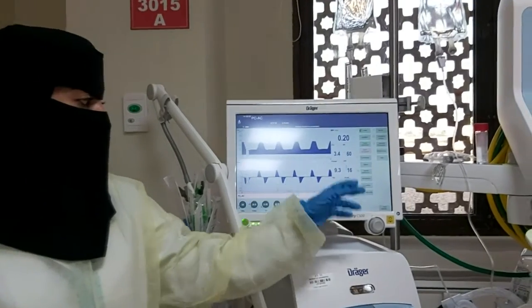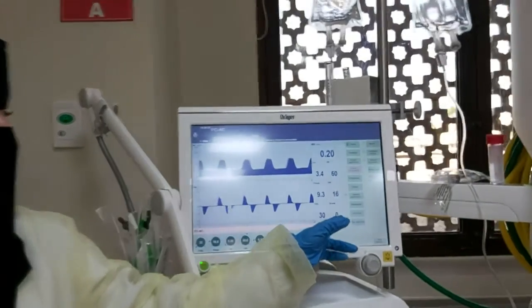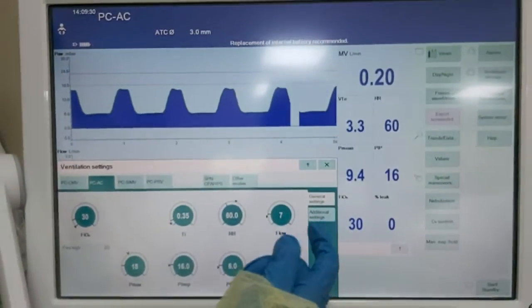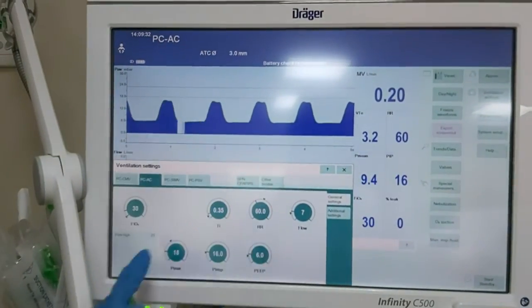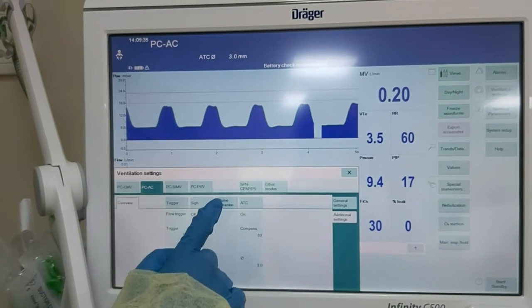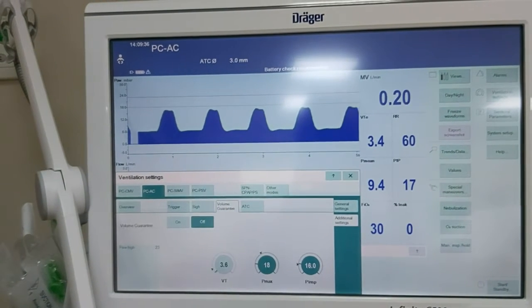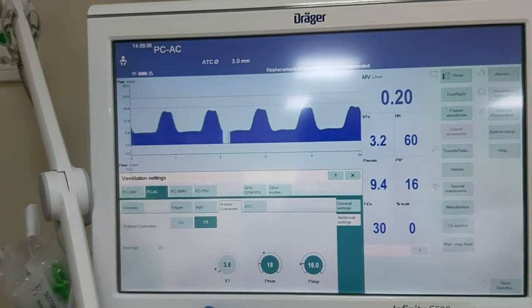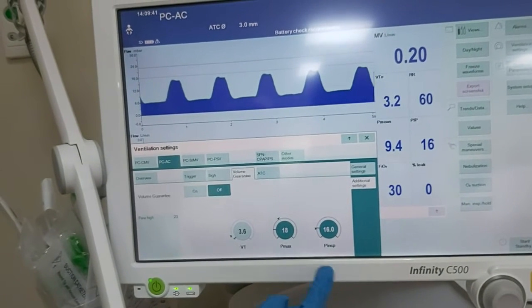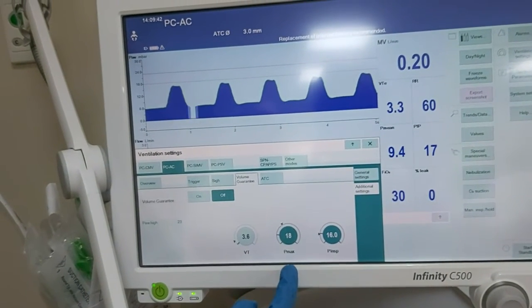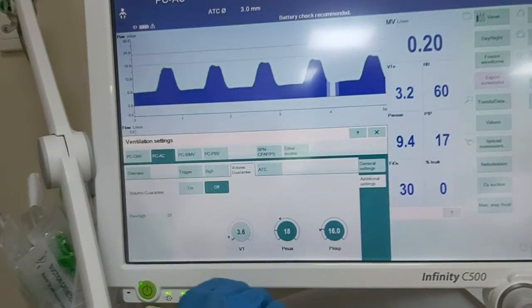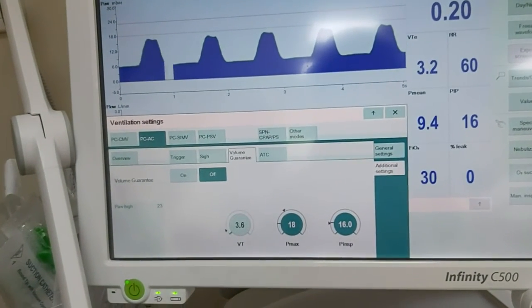To add volume guarantee, we put it on pressure control under additional settings. Here is the volume guarantee option. We have three respiratory parameters: pressure, Pmax — which is especially important in this case — and tidal volume.